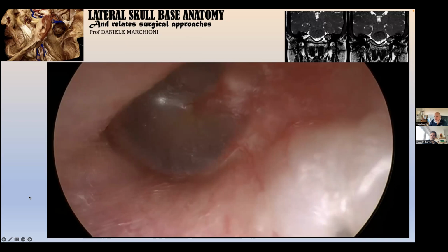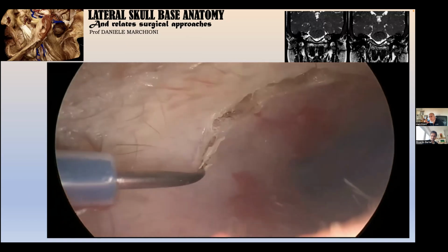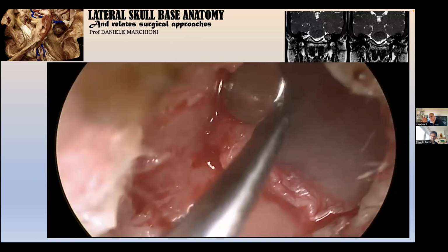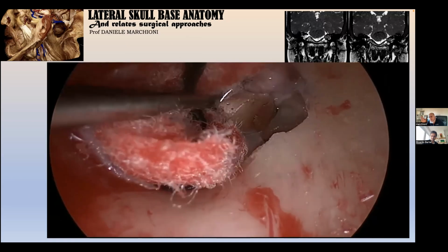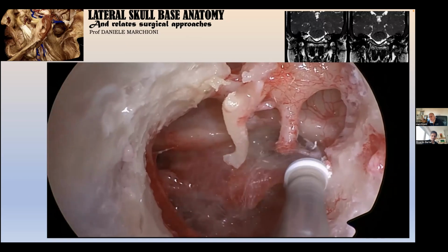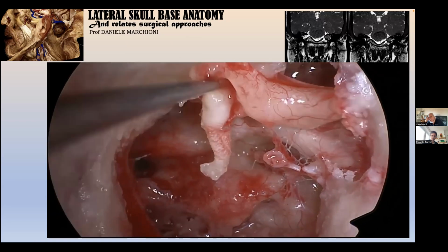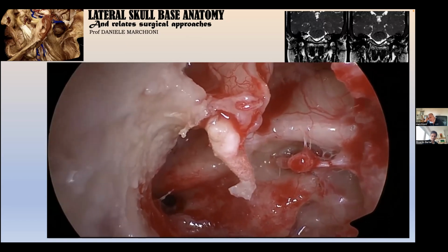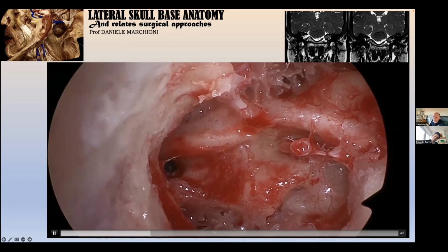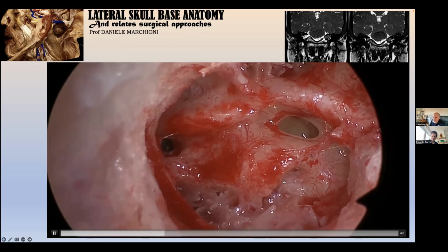This is another case of acoustic neuroma growing during the time. Another important aspect of this approach, of course, is that all the patients should have a hearing loss, of course, neurosensory hearing loss, and this is really important. So now we can see the drilling time and the removal of the incus here, removal of the malleus. Again, after ossicular chain removal, we are able to see the facial nerve, the stapes, and we can start to see the removal of the stapes with the vestibule.